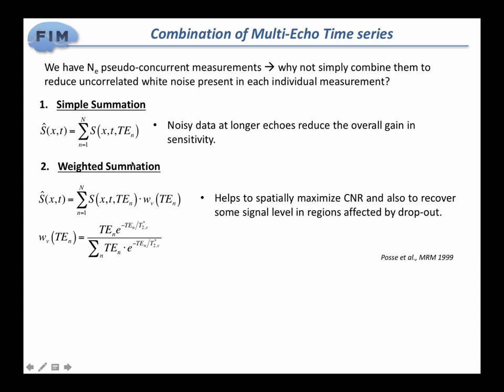But there are other ways in which we can get a better weighting of those different time series so as to optimize the contrast to noise, the BOLD contrast to noise, which is what we want. And that's what we tend to call optimally combined. I'm not going to go into the details of how those weights are derived, but just think of this as something you can compute out of your data very easily. The tedana software includes the computation of this. I think this is very easy to implement in AFNI, Daniel can tell us. But if you want a little program to do this, I can give you code.